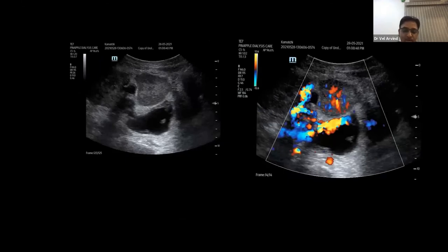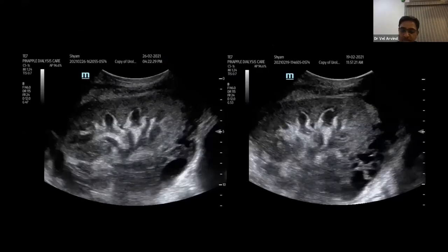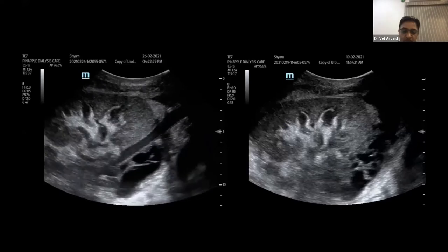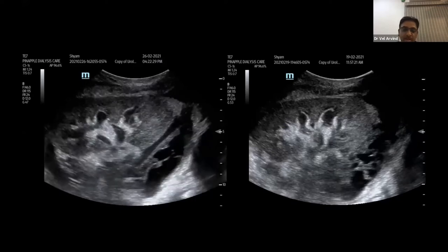It's very echolucent, so I'm not worried about it. It's a very small collection. It doesn't interfere. It's not vascular. Sometimes echolucent might be an aneurysm also, but it's not this kind of aneurysm, or maybe you have to rule it out. If it's a smaller one, you have to rule out all those things. And this is another collection, a small upper pole collection. We are not worried about it. This is near the hilum. You can see the vein is abutting that collection. It is a very small, septate one. Mostly it's blood which has got lysed, so we are not worried about it. The flow is good. Kidney flow is good.